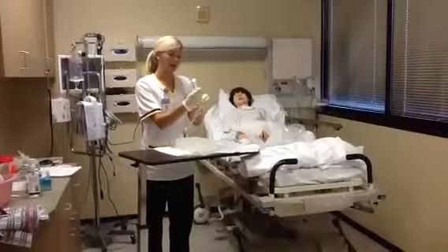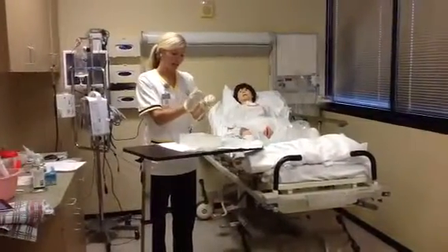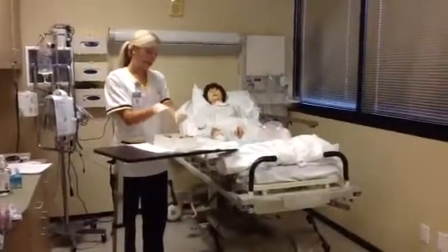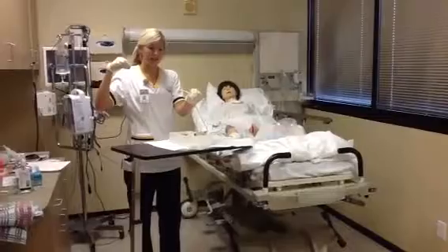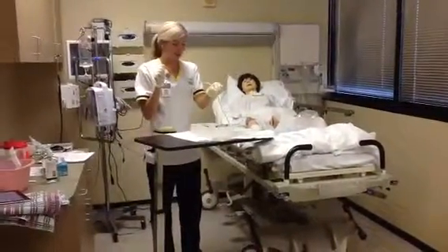So I can go ahead, hook that up, place that back in the box. I'm then going to grab my catheter and take the sheath off, making sure that the catheter is not touching anything because now that it's sterile, I want to make sure I'm holding it secure, and I'm going to drop the sheath over here.